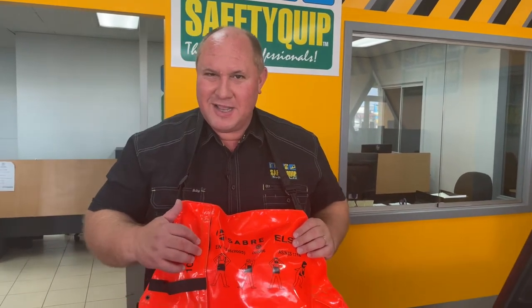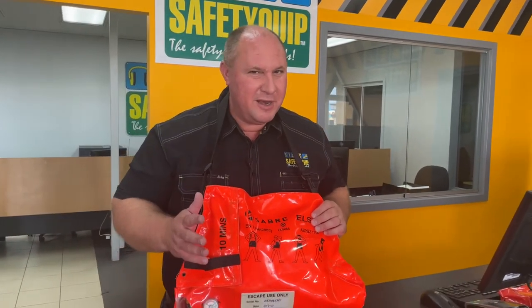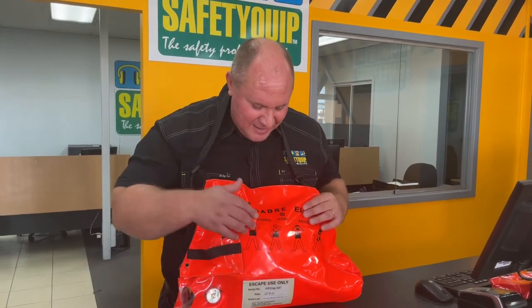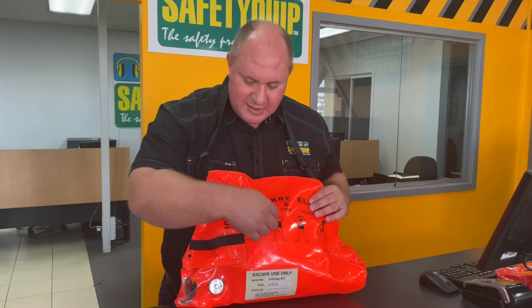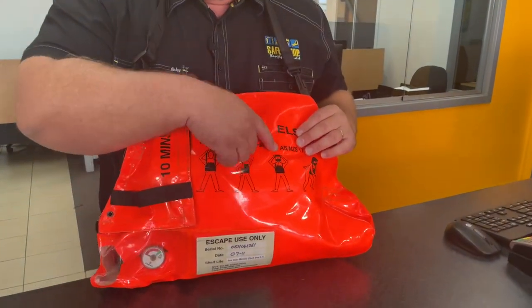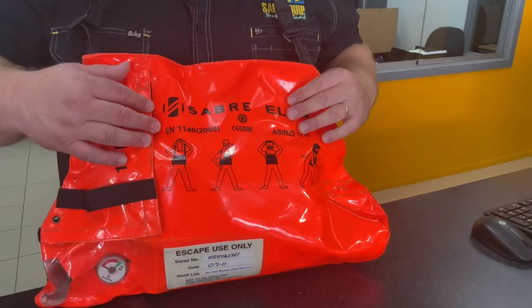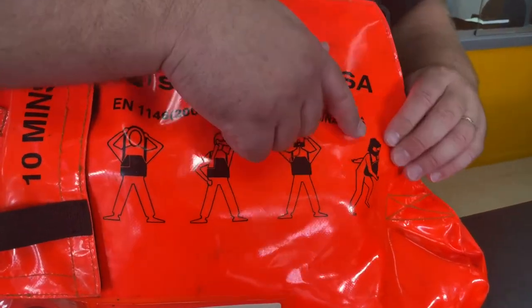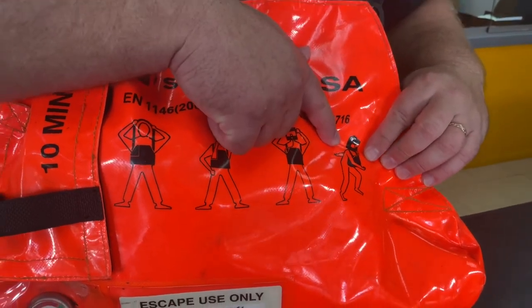This one is labeled as 10 minutes, but the 10-minute unit is no longer made — we only make a 15-minute unit now. My demo unit is an older bag. That tab is pulled up, then the hood is removed from the bag and put over the head. Of course, the air is being dispensed at that point and you use it to escape from the area.